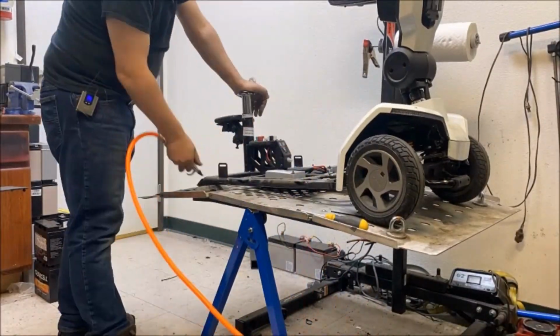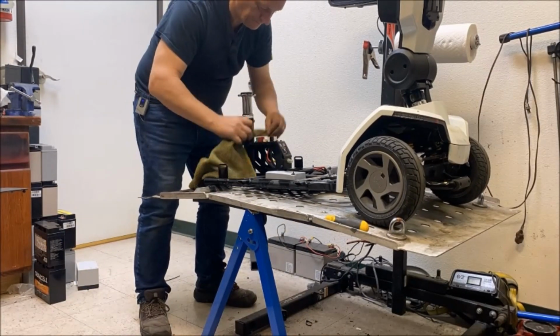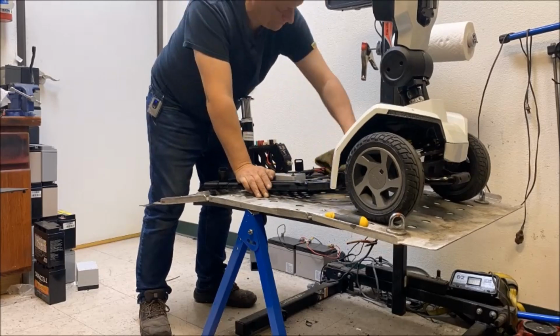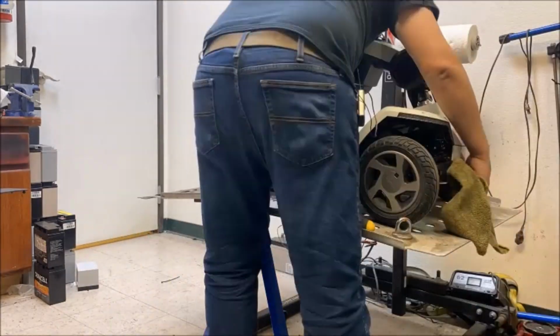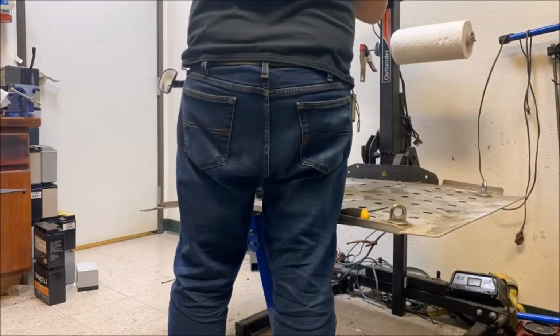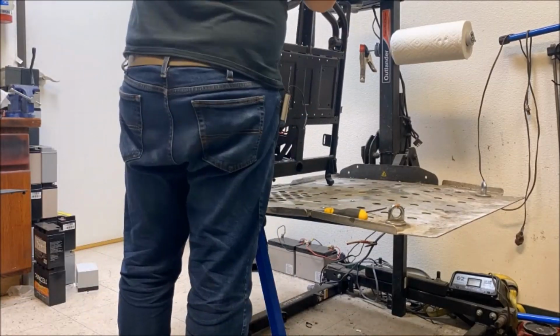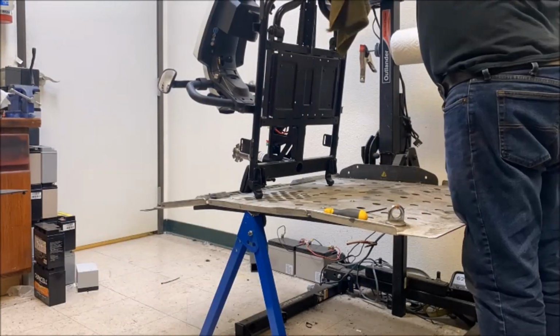As you can see, I use an airline to get out as much dust or debris that may be inside the frame or the components that need to articulate, like this version has a front suspension, and also any wiring connections. Just blow out as much as you can.